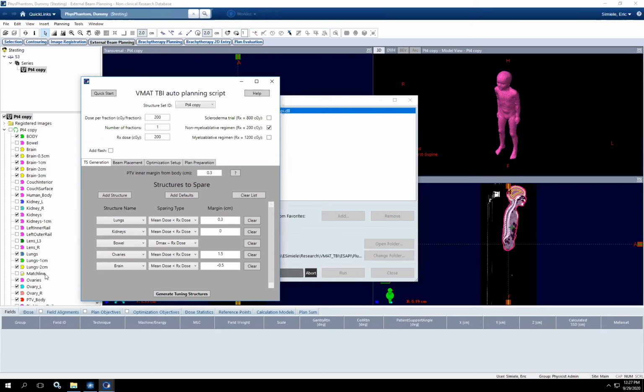It's an indication that you want to do VMAT with APPA, as I mentioned. If it's present and filled, it'll go ahead and start generating the structures for VMAT and APPA. If it's present but not filled, as was the case here, it picked up on that and it's asking, hey, did you insert this but forget to contour it? Or did you insert this by mistake?